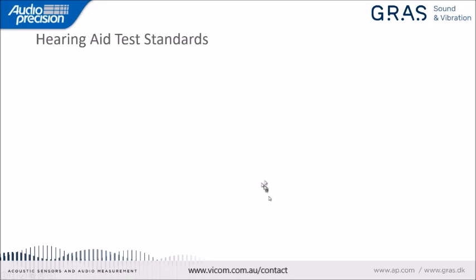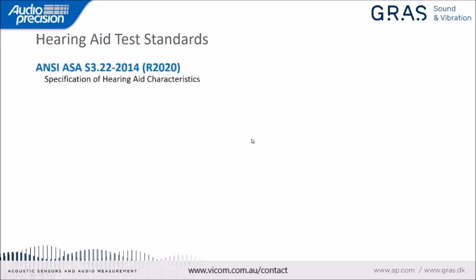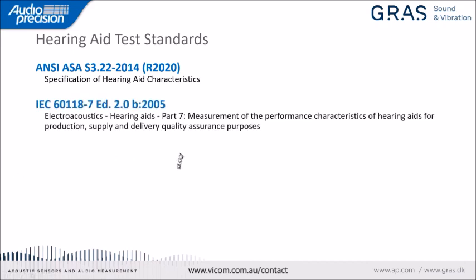Now let's talk a bit about the hearing aid test standards. One of the main ones is the ANSI ASA S3.22. This was revised in 2014 last and reaffirmed in 2020. The title is Specification of Hearing Aid Characteristics, and this is widely used for production test of hearing aids. A similar standard from the international series IEC 60118. So 60118 is a multi-part series. I think there are 15 parts to the series. And this one, part 7, is titled Measurement of the Performance Characteristics of Hearing Aids for Production, Supply, and Delivery Quality Assurance Purposes. So this is very similar to the ANSI standard.